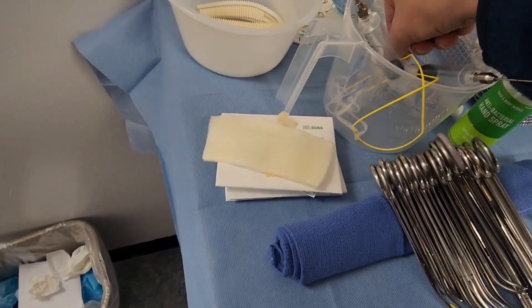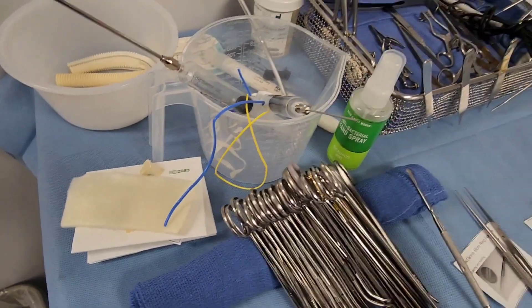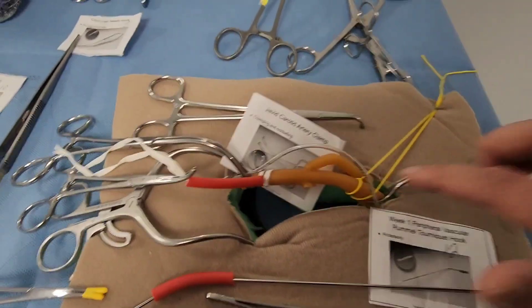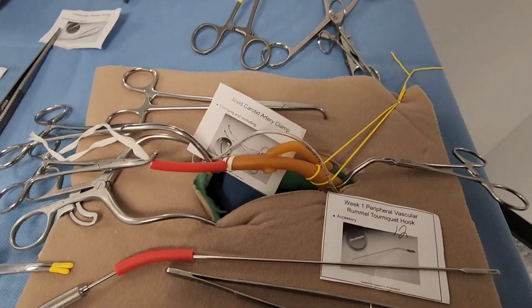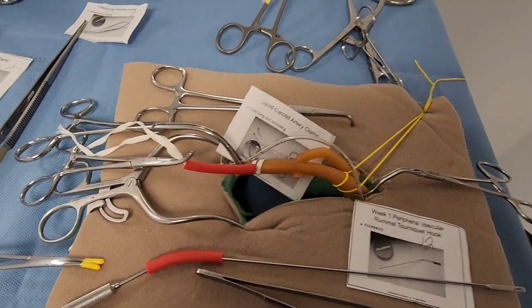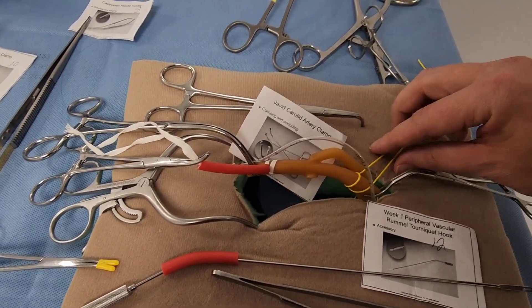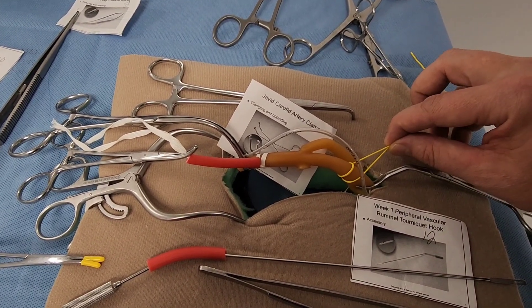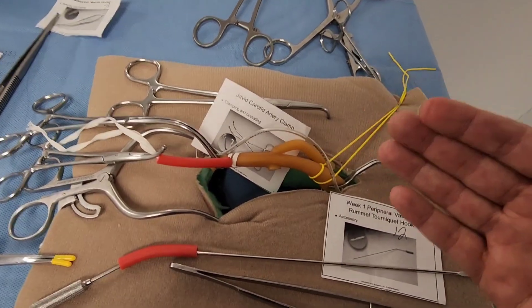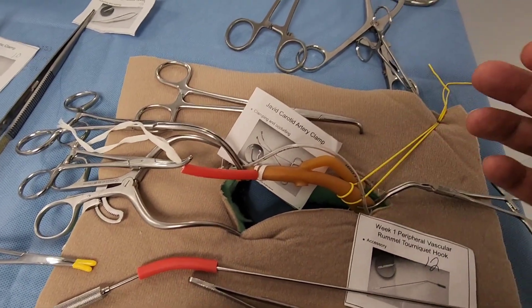Vessel loops come in different sizes and colors — yellow, blue, many options. Here's a crude example of a carotid: in a carotid endarterectomy, we have to isolate the internal, external, and common carotid. The vessel loop is wrapped around the vessel — it's a retracting device that retracts the carotid, stops blood flow, or lets it go, controlling that blood flow.